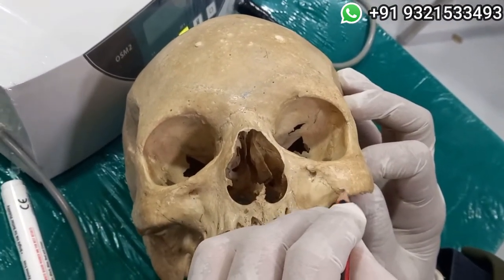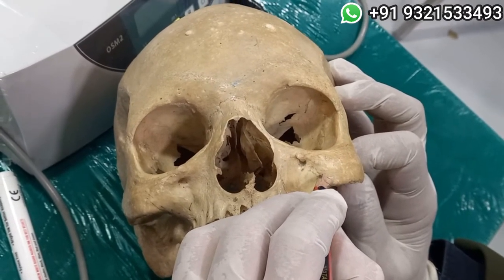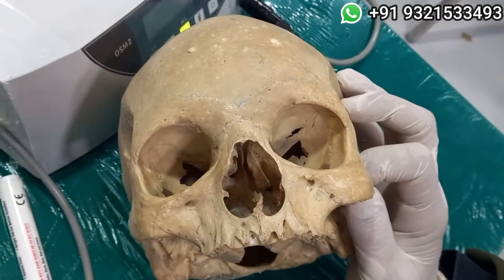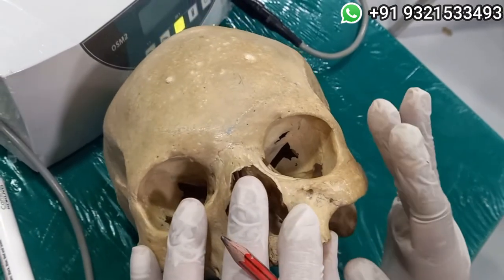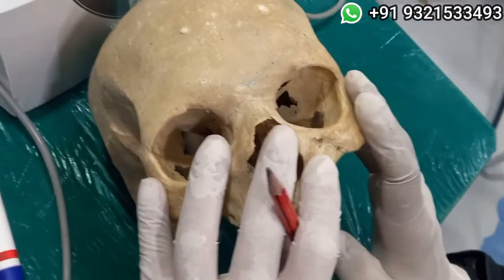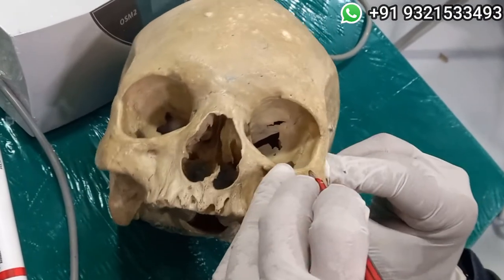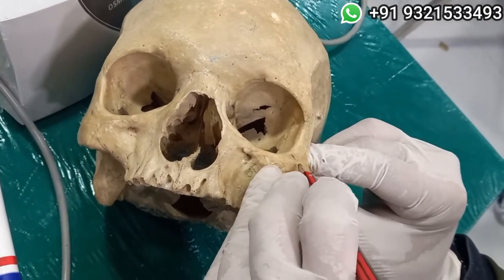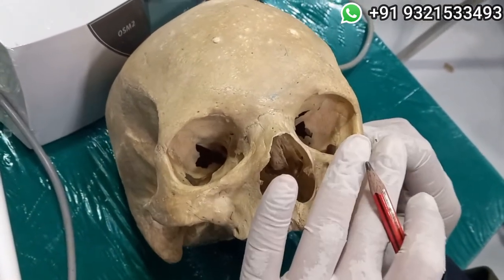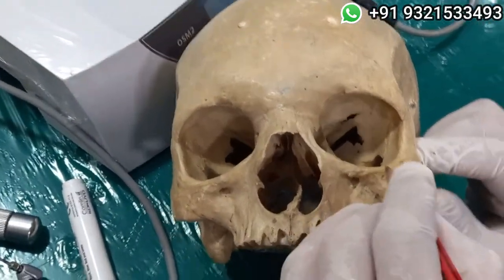So wherever the meat of the zygomatic bone is there, where it is starting, from there you take approximately 5 millimeters marking. This is point B. So you have your point A, point B, and before you start, you just palpate, which you can palpate extraorally also. I just palpate over here and I can make out, yes, this is my zygomatic bone. So this is the rough point C, which is roughly 5 millimeters away, but the point C will come automatically. It is just that this is where we intend to exit. Okay, 5 millimeters away from the orbit.